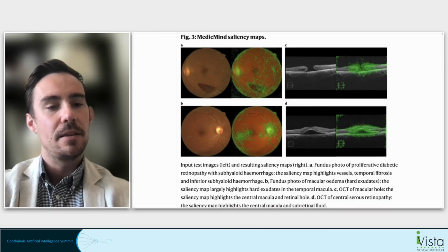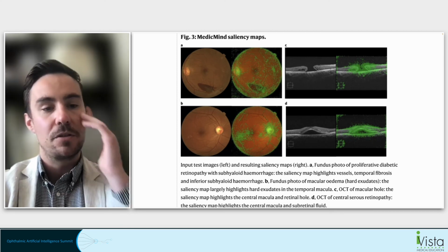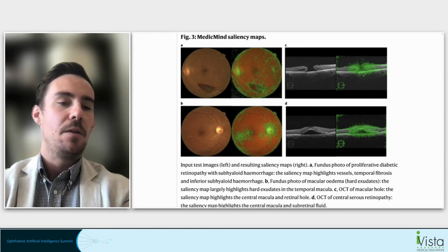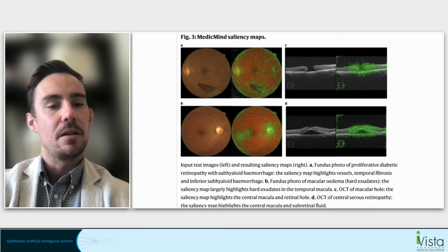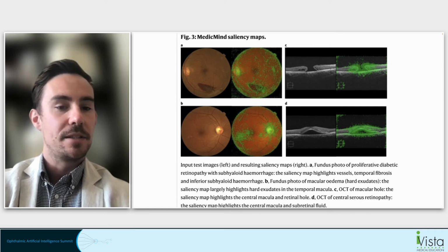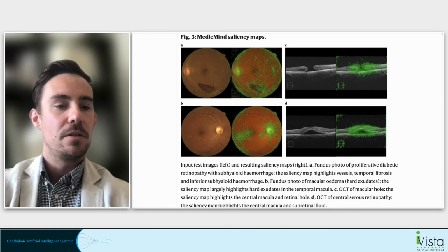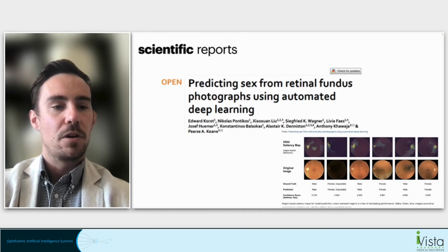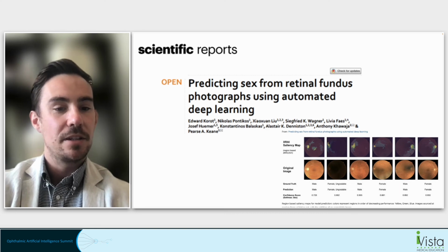And so one of the other main things that we wanted to address was looking at the saliency maps to try to address explainability. And while there are a lot of issues with these kind of maps and a lot of pitfalls, this is a place to start. And so in a more inherently opaque platform, such as AutoML, where you don't pick the actual features and things like that, we thought that this was important. So in our follow-up work on this, we decided to evaluate the use of region-based attribution maps on something that clinicians actually cannot do.